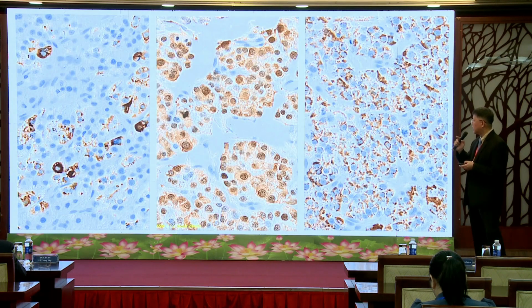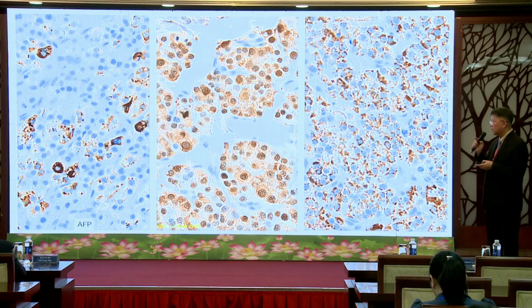So I did immunohistochemistry: AFP positive, arginase 1 and HepPar 1 positive. So this is metastatic hepatocellular carcinoma.